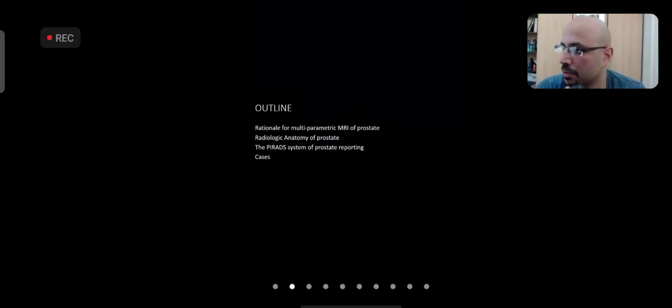So I'm going to speak a few words about that first. Then I'm going to move on to describing radiological anatomy of the prostate. Then I'm going to move on to pathology of the prostate, which is prostate cancer, and the PI-RADS system. I hope the majority of the people are acquainted with it. PI-RADS system.